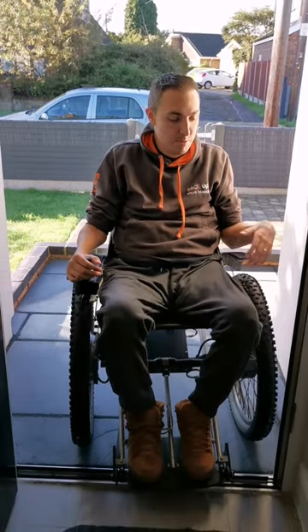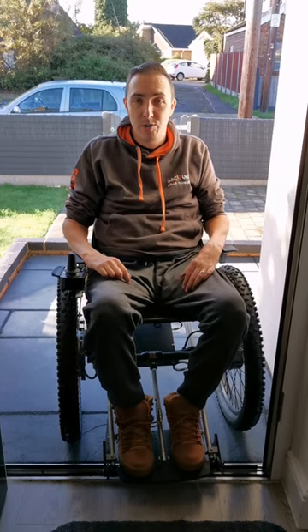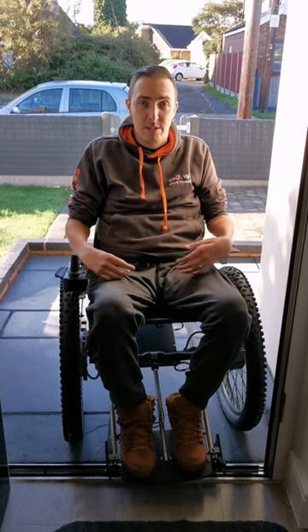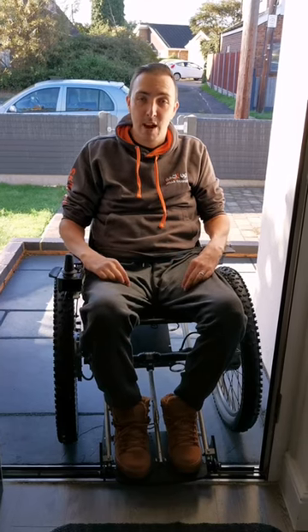Hi there, I'm Chris from Backup. Today we're going to have a quick look at manoeuvring in a power chair. This particular chair is a Trek Kinetic GTE. It's powered at the front wheels and steers at the rear. There are various types of power chairs — from front, mid to rear power chairs — and they each have their own characteristics.